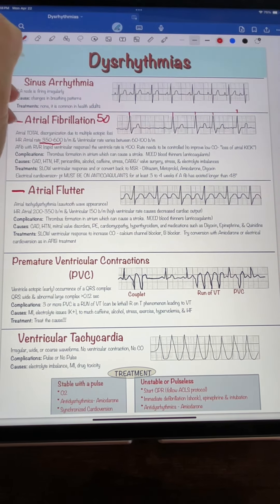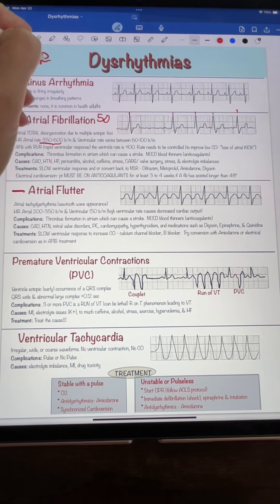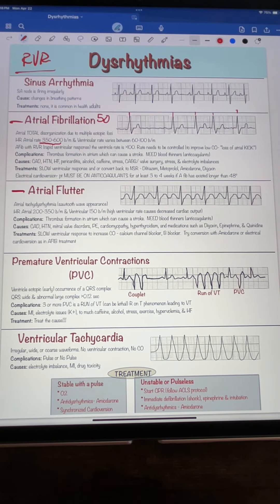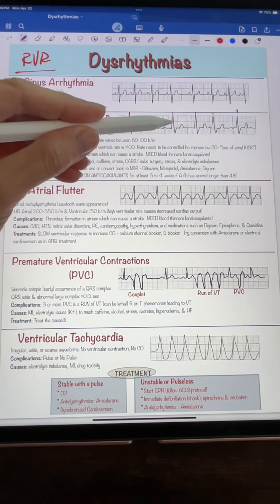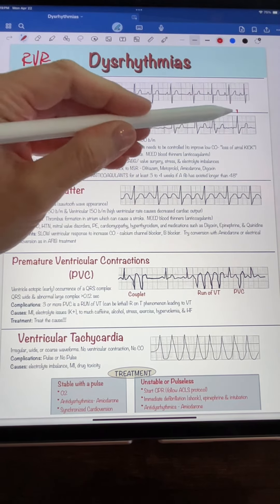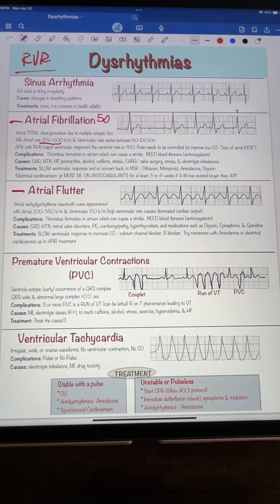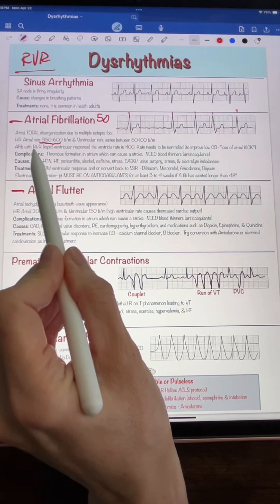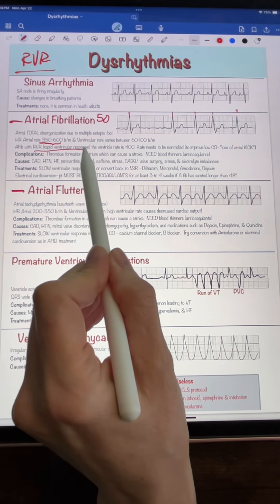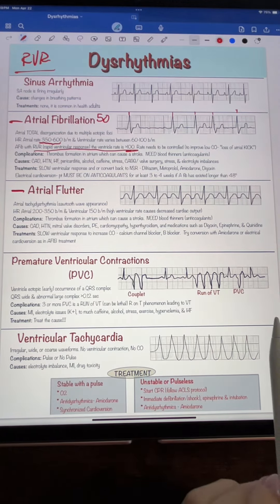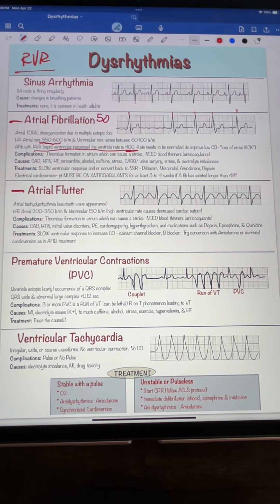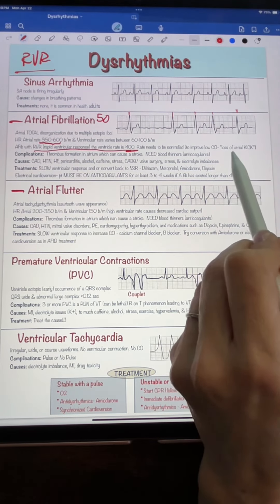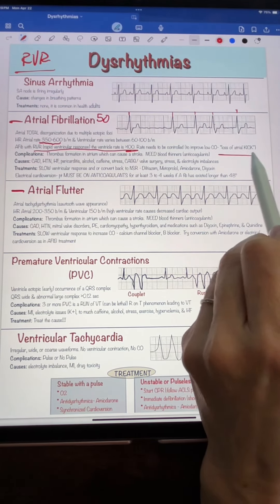You've probably heard about RVR — when somebody is in atrial fibrillation with RVR, that stands for rapid ventricular rate. That means the ventricular rate is going very fast. Typically, if the RVR is going over 100, you're going to lose your cardiac output.